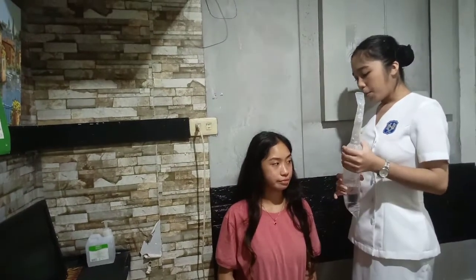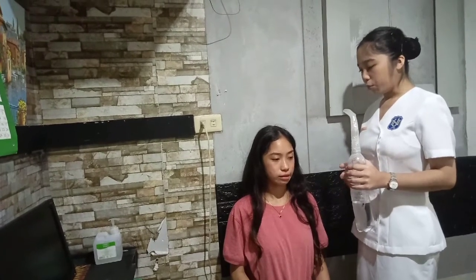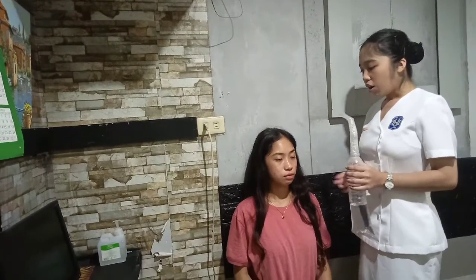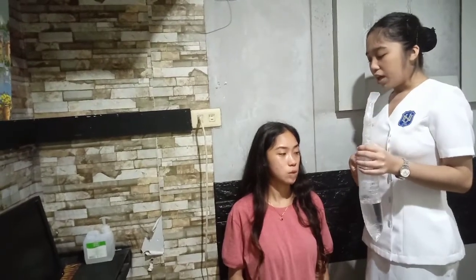I advise that you do this 5 to 10 times every hour so that your lung capacity will improve. And also, if you feel any difficulties in breathing, you can call me. We also have to record if you reach the goal. Like today, you reached 2,500, which is higher than what we expected for today.